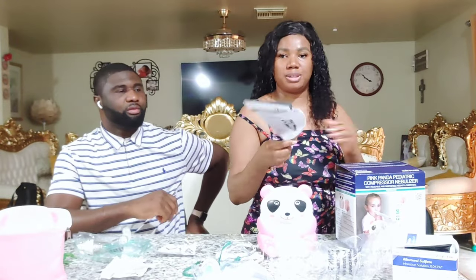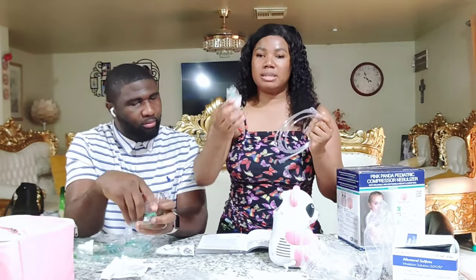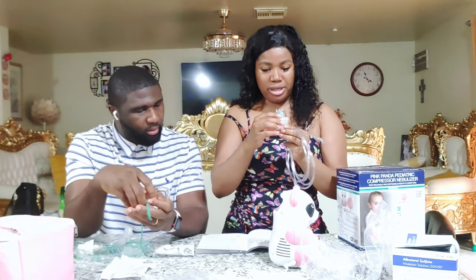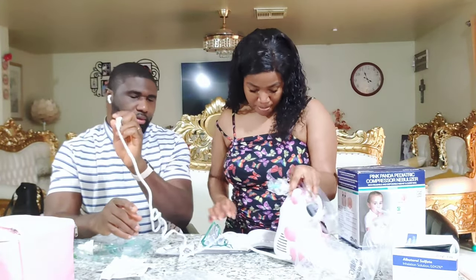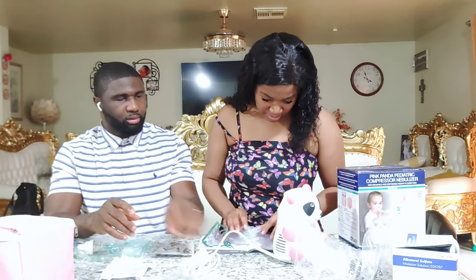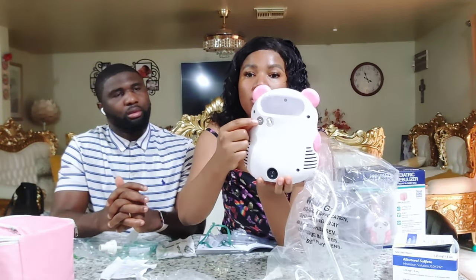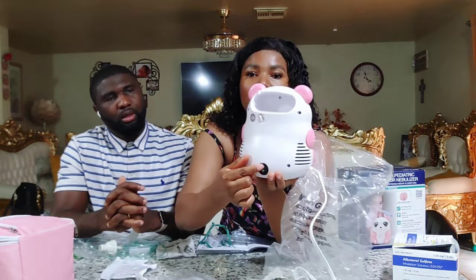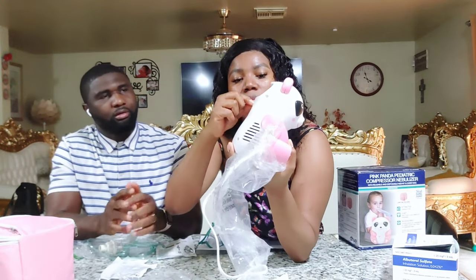It came with instructions, and it says this is the air tube. This is a nebulizer. I guess your medication goes in here, and then the power cord. So that's the power cord. And what else? Back here, this is where one of the tubes goes in. That's the switch, up and on. Make sure it's always off. The control switch. And that's the air filter.